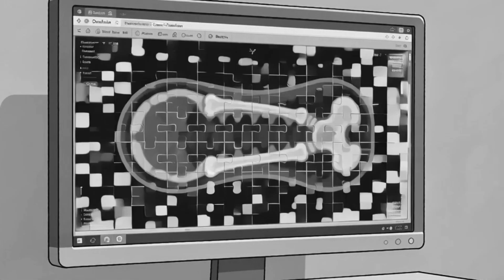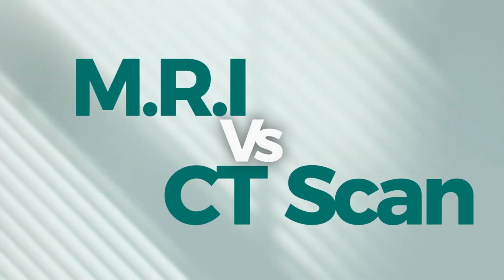And as it goes back, it gives off energy. That energy it gives off helps us to generate the image. Where we have more free hydrogen atoms, the signal intensity is quite high, and we shall see that on a T2. So roughly that's how images are formed. We need a magnet, we need a radio frequency, and then we need a receptor whereby we generate images. The physics is really, really complex.